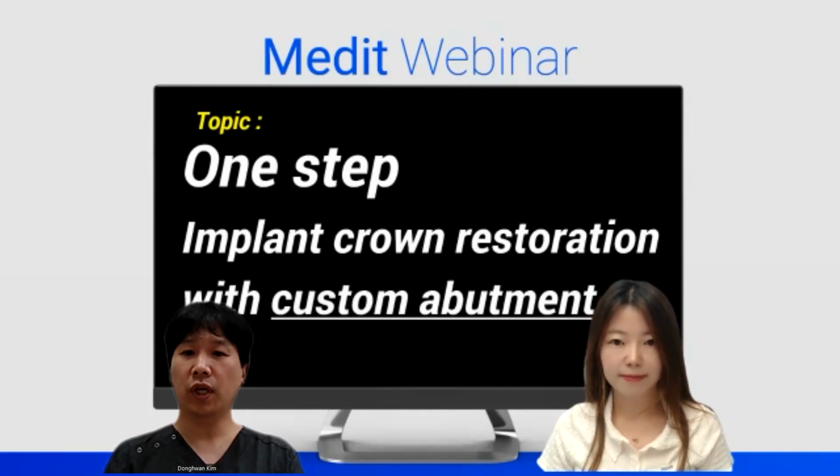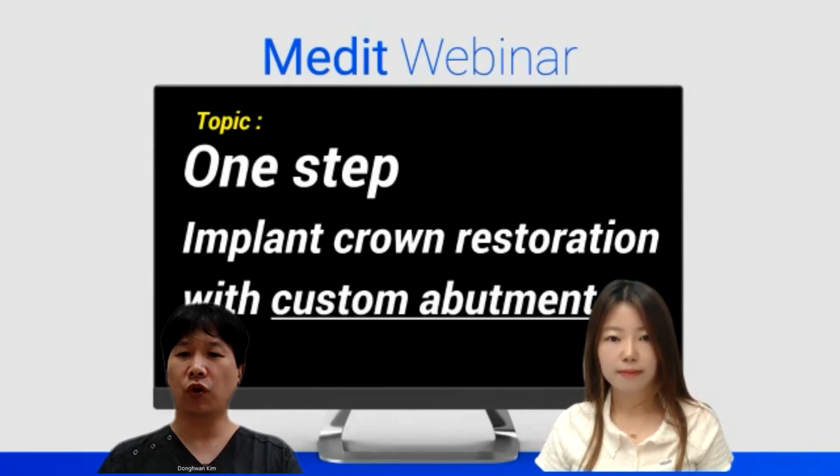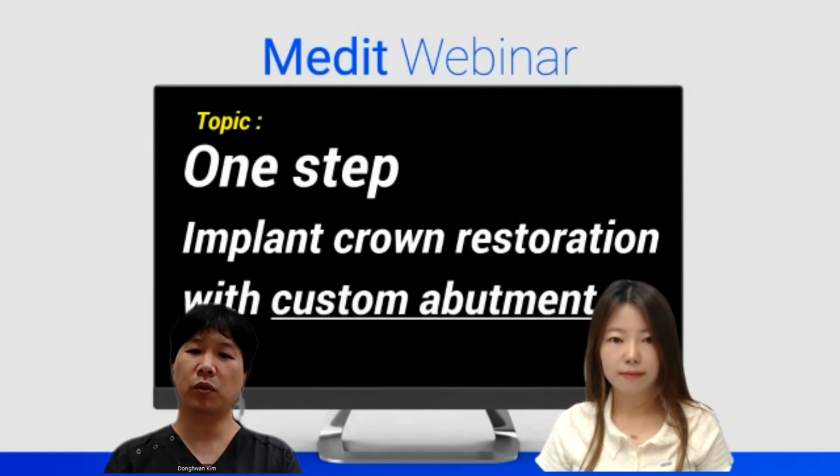Yes, of course. I'm sure many dentists have concerns about the perfect fit of crowns, especially with custom abutments. So I'm going to focus on compensating for the errors of custom abutment fitness that come from processing. I've tried several experiments to overcome these processing errors of custom abutments, and I got the idea. So I'm very willing to share the tips with you today.